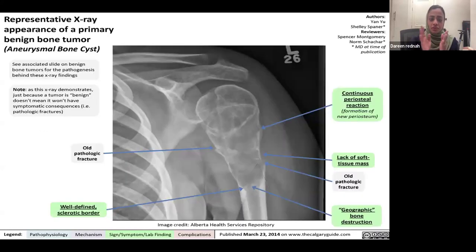In oncology, for example, we have this. This is a pathological fracture, with well-defined sclerotic borders and geographic bone destruction. There is no soft tissue mass. There is a periosteal reaction forming new periosteum which looks benign, not a Codman triangle, which may indicate aggressive features. All this suggests benign features. Differential diagnosis is 1, 2, 3, 4. It's systematic in oncology. You have to mention 7 things in images when it comes to oncology.